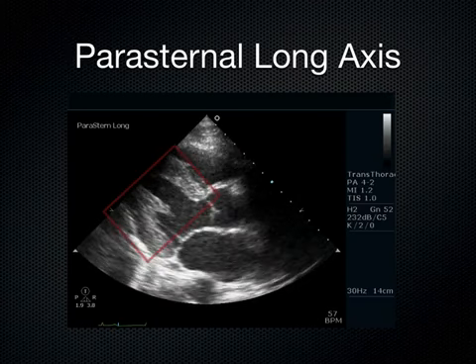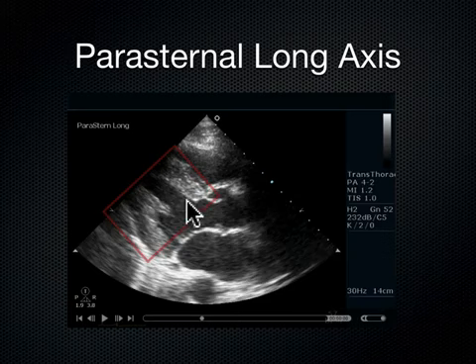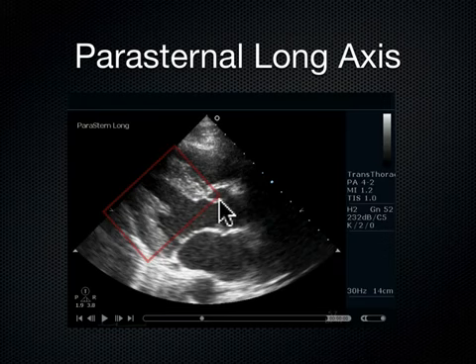Let's call this right here end systole. How do I know that is end systole? Well, the posterior wall and the interventricular septum are close to each other right there, and this aortic outflow tract, that's open. This is the one leaflet of this aortic valve. It's a tricuspid valve. We don't see all the leaflets here. There's one leaflet. We can see it's clearly open, and I'm sort of hallucinating a little bit. Maybe that posterior leaflet down here is also open, and the blood's coming out during systole.